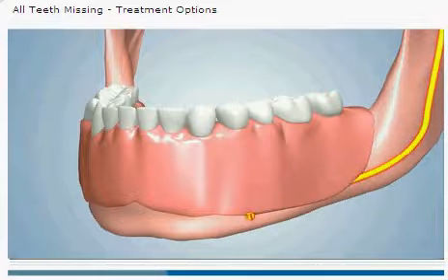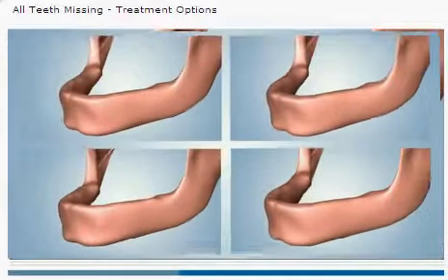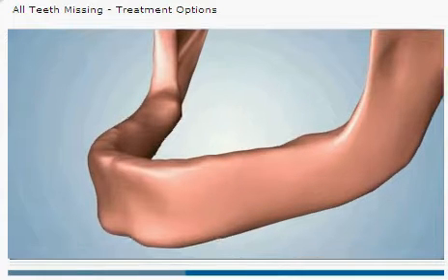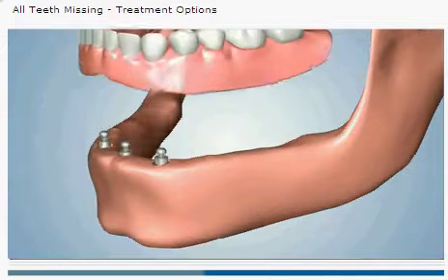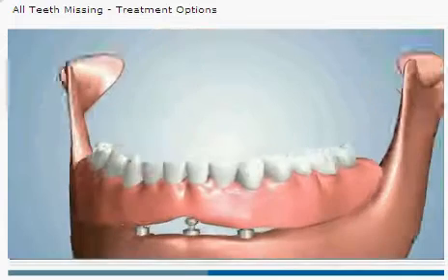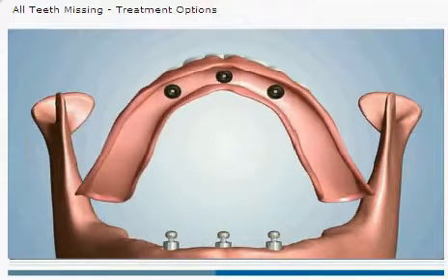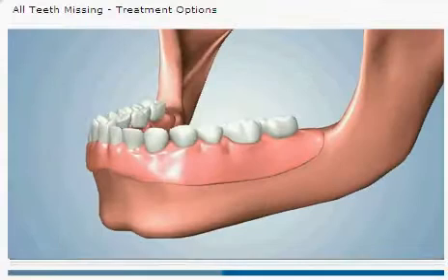The only proven way to prevent or stop bone loss is to replace your natural tooth roots with dental implants. One option may involve the placement of two or three dental implants. The implants help prevent bone loss and provide a stable foundation for a denture. A connection type known as the ball and O-ring attachment is used so that the specialized denture can be secured to the implants, yet removable by the patient for cleaning.